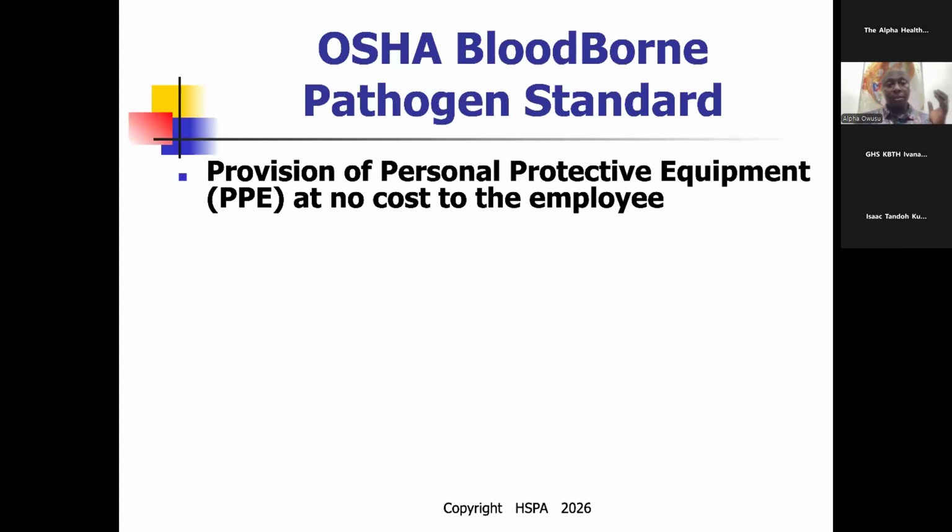Again, the provision of PPEs. You go somewhere and they say we don't have, right? I went to some facility, they used a hair cover as a shoe cover. How is that possible, right? From your shoes all the way to your knee should be covered, right?